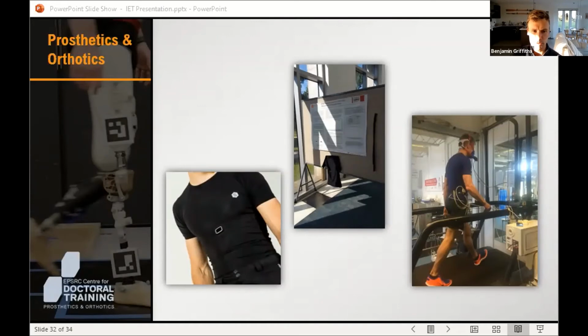The reason I bring this up is because in the past, the university has partnered with pretty interesting wearable technology startups, including a company that developed smart textile systems with the aim of creating unobtrusive monitoring devices. The system used conductive textiles to pick up electrical signals from the body, like heart rate and EMG signal measurements. And systems like this have the potential to feed into our P&O research by creating more adaptable and useful monitoring products. Specifically, this kind of system could be used for something like developing a myoelectric prosthesis through their EMG measurements. But these are just a few ways that our research is getting out into the wider community.